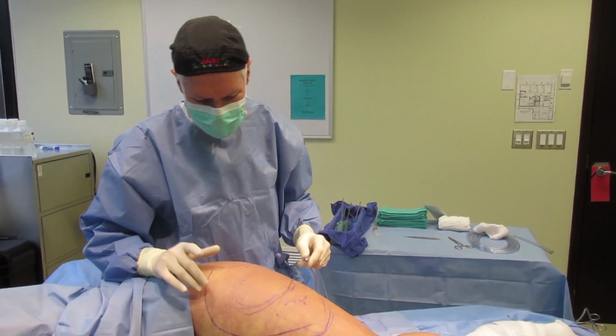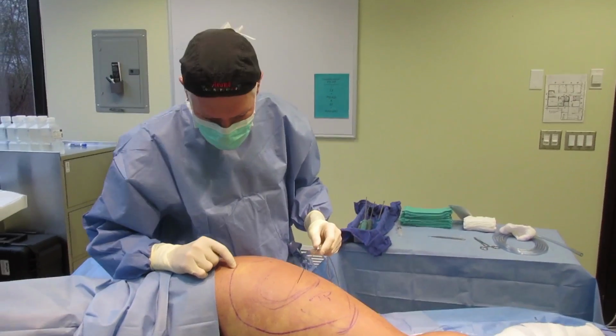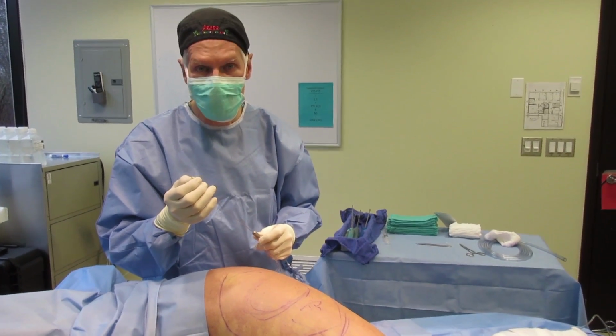I've already anesthetized her locally. She's got sedation on board, so she's relaxed. I've made very little incisions here, enough to pass these cannula, which is a blunt-tipped cannula with a lot of little holes at the end of it.